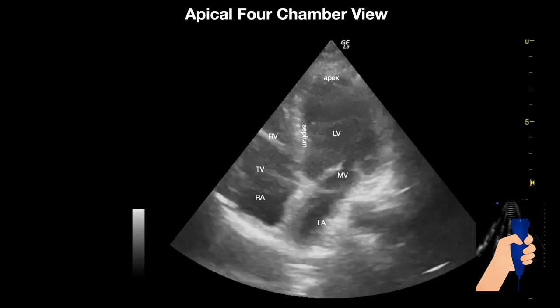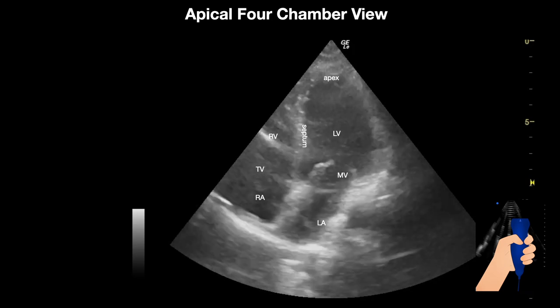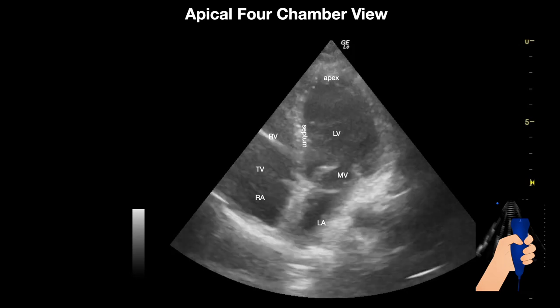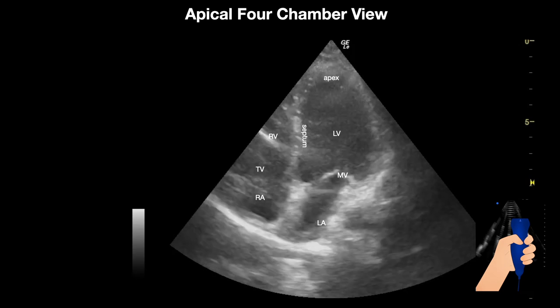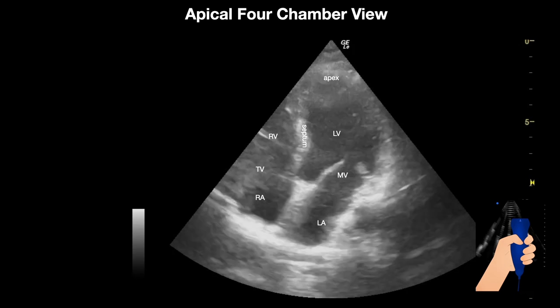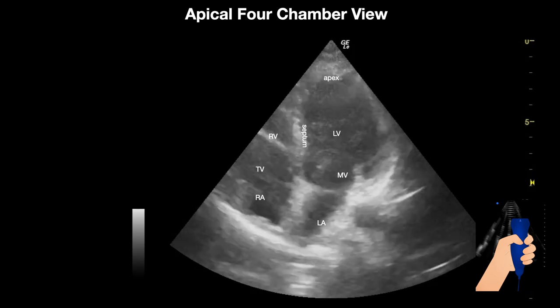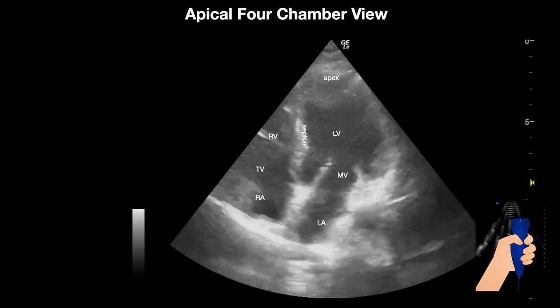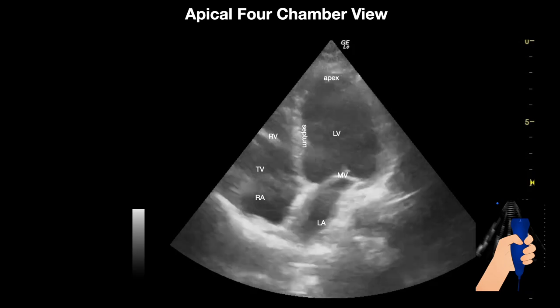This is a normal point-of-care ultrasound and this patient has normal heart function and normal size of all chambers.